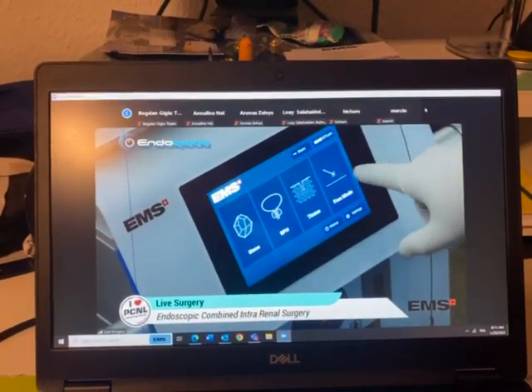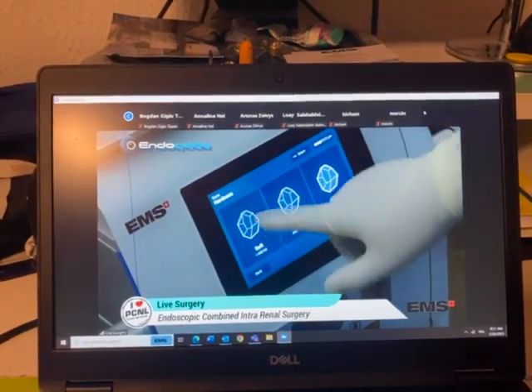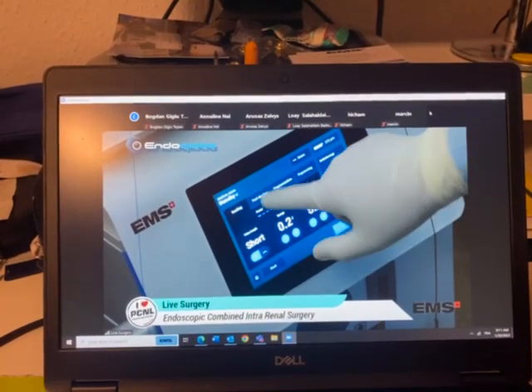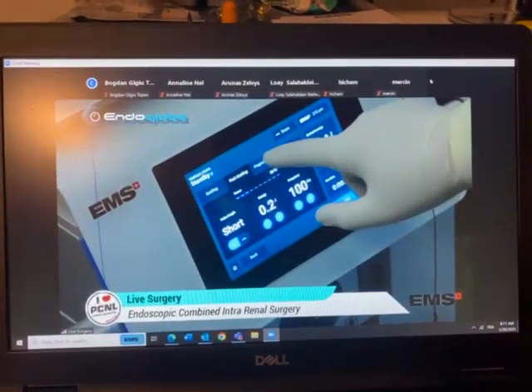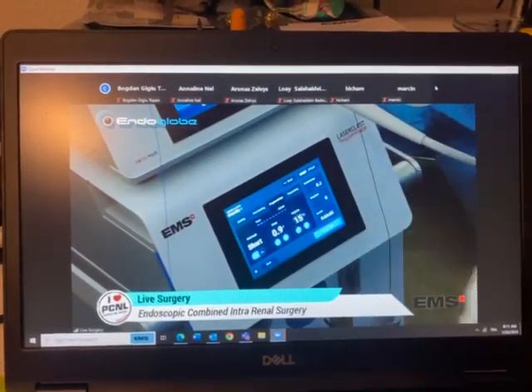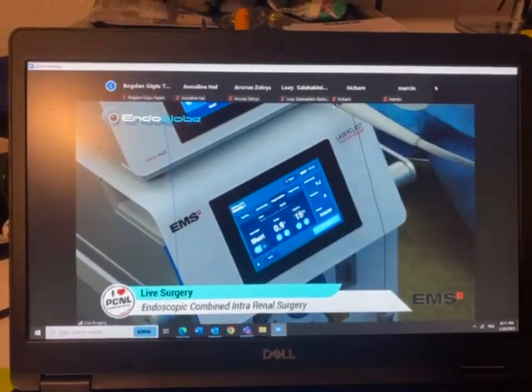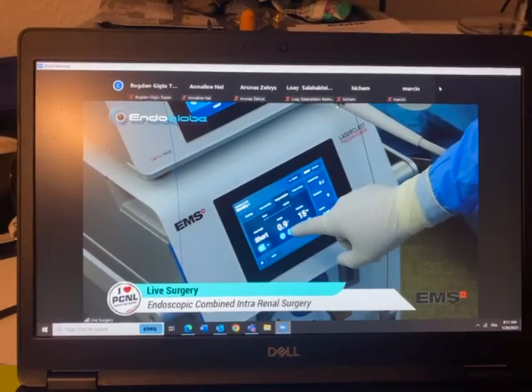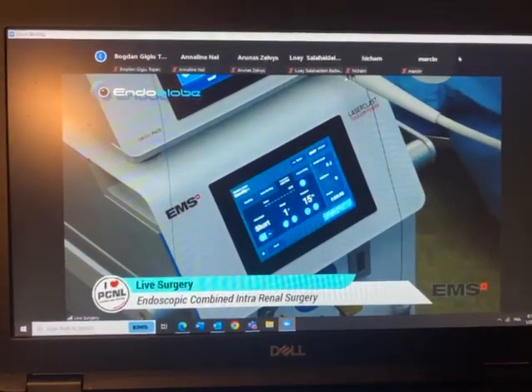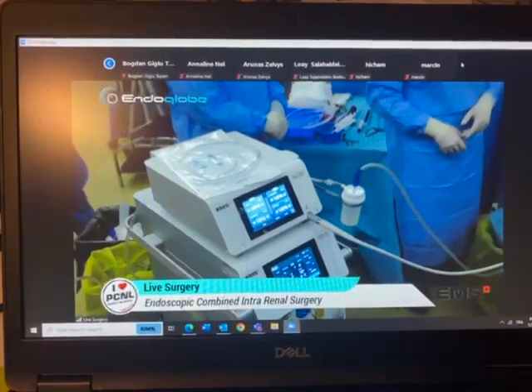And here you see that there are already presets for different case scenarios. So we start with a stone. There are different presets for soft, medium, hard stone. I will go for medium and then set it up according to the case. And here you see that there are already presets for dusting, fast dusting, fragmentation, popcorning, depending on the case scenario that you have. For the moment I'm going to set it up for fragmentation, because in the cases that we have here, usually you don't need to do dusting. All this is going to be explained during the surgery also. I'm going to increase also the energy. We have a lot of fragments that can be evacuated by the lithotripter. So this is more or less what is related to the lithotripters that are going to be key players during the case that you are going to follow.